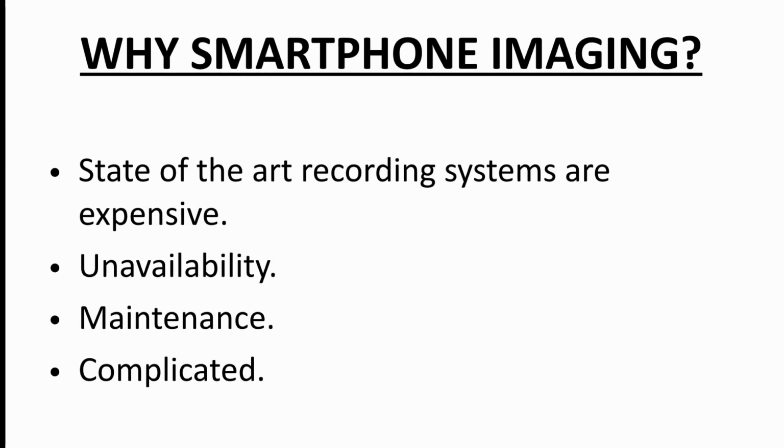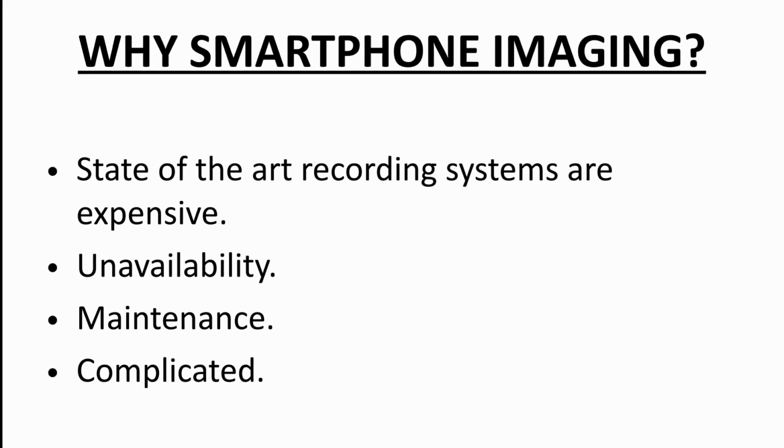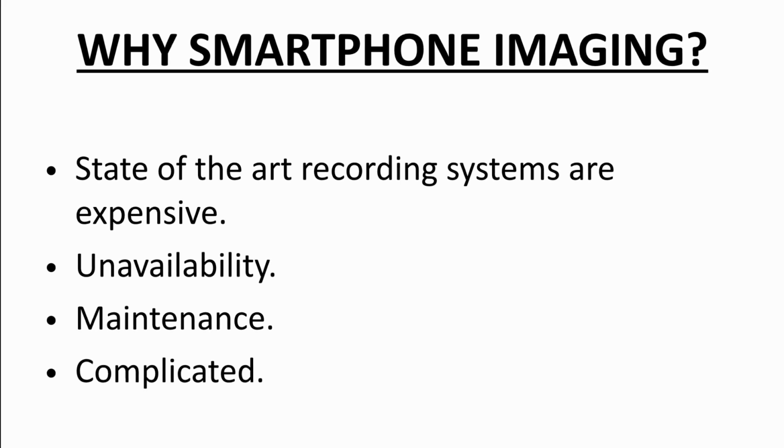First of all, I want to emphasize why smartphone imaging should be done. As we all know, the state of the art recording systems are expensive. Many of the times they are unavailable. They require a lot of maintenance and they are quite complicated to understand.